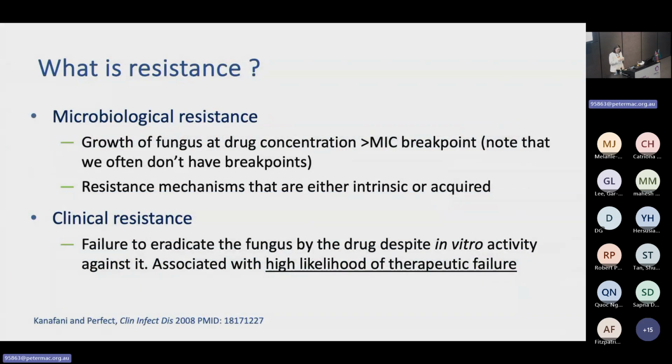In the ACSIII study, we're collecting MICs really to get a snapshot of resistance rates in 2024. But in the clinical setting, I guess, and saying this as a non-clinician, we perform susceptibility testing in most cases because we want some data to support our treatment choices.